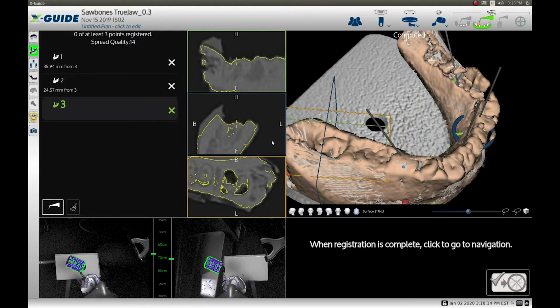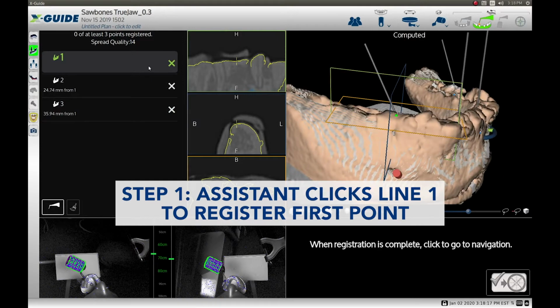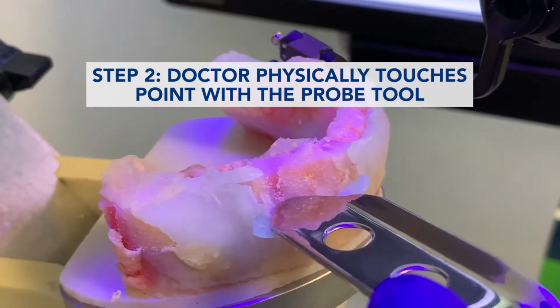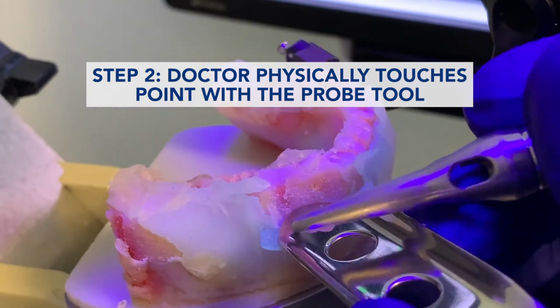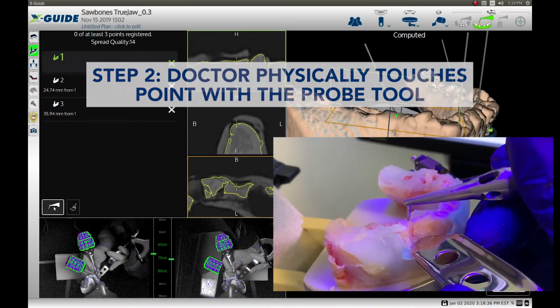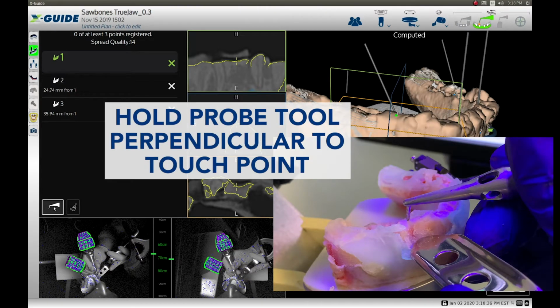Now we will physically register these 3 touch points on the patient. The registration sequence is critical. Number 1, the assistant should click on the line item number 1 on screen. The line item will highlight in green, and notice that the 3D render image will auto-rotate to that point. Number 2, now the doctor with the probe tool will physically touch that point number 1 on the patient's jaw, all under the camera system, 60 to 80 centimeters distance. Please note that it is important to hold the probe tool perpendicular to the anatomical touch point.